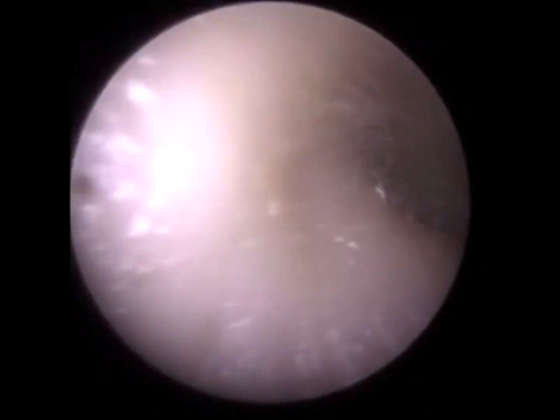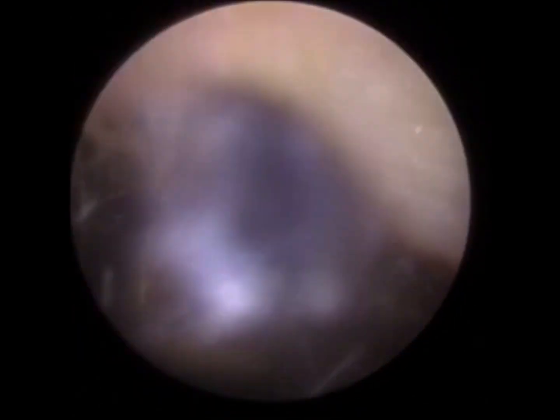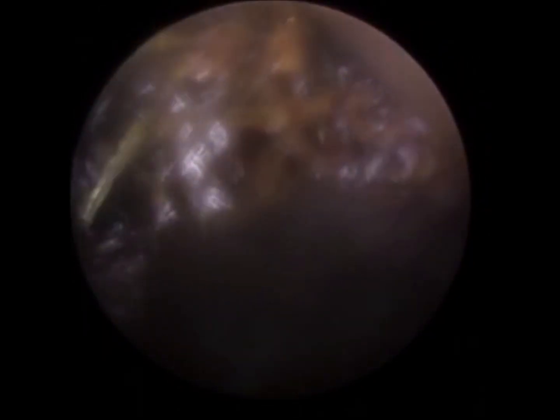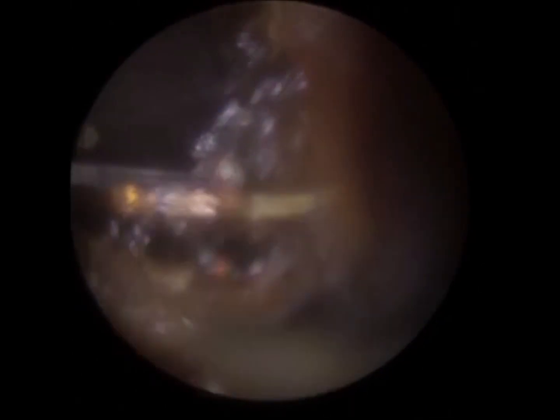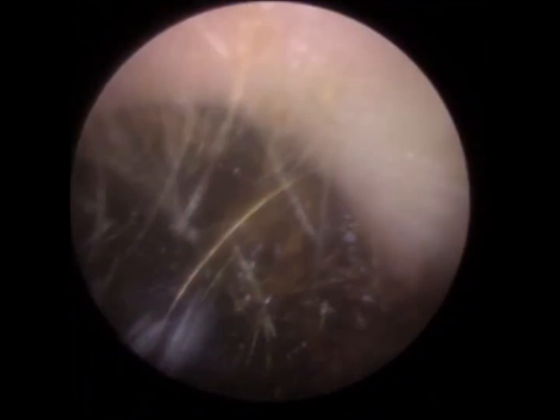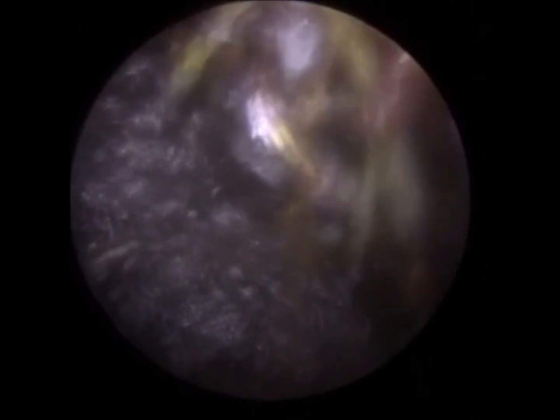So do bear with us, guys. We do get this out in the end. You'll see we're left with a squeaky clean ear canal, and I'd recommend watching the video because you can see all the contents of the ear and the tissue. You would have seen that on the thumbnail as well, but we're not too far away now, so you can see the tip of the endoscope there. It's just a bit smeared with some wax.